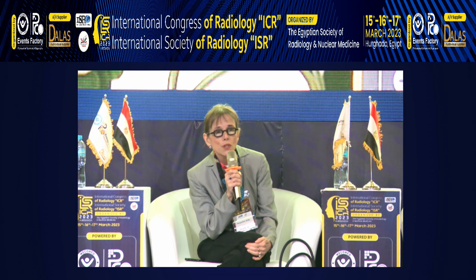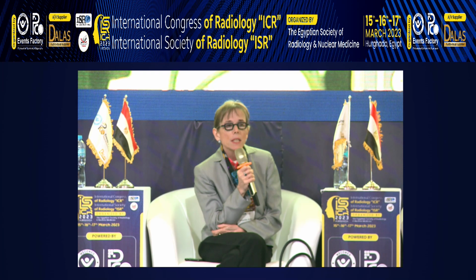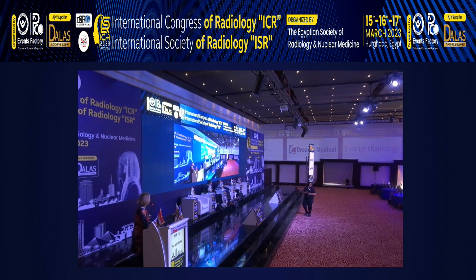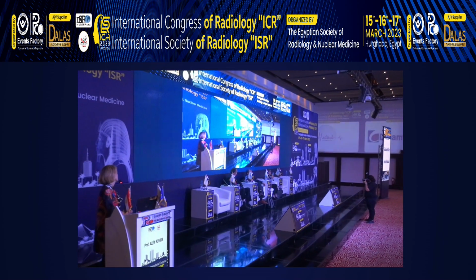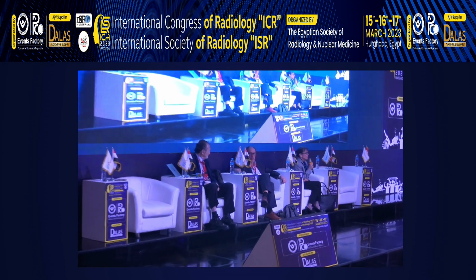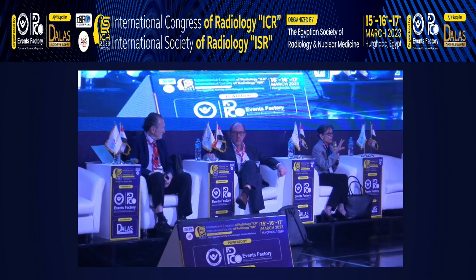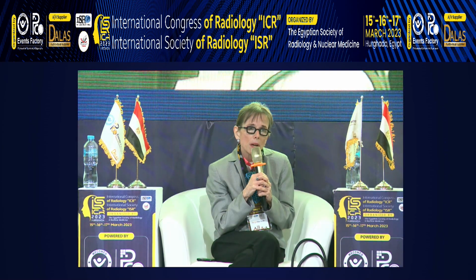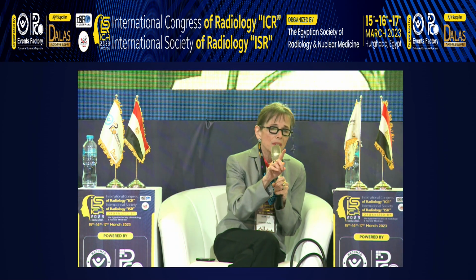So thank you for the question. For the case that was the grade 2 astrocytoma, we first thought that it was a low-grade tumor. And why didn't we think of something non-neoplastic? If you remember, the FLAIR imaging did show the surrounding white matter pattern of edema that we thought was a bit more likely to be neoplastic.